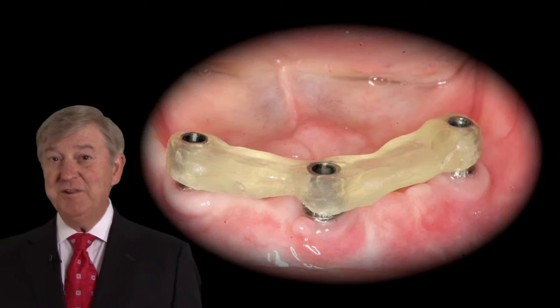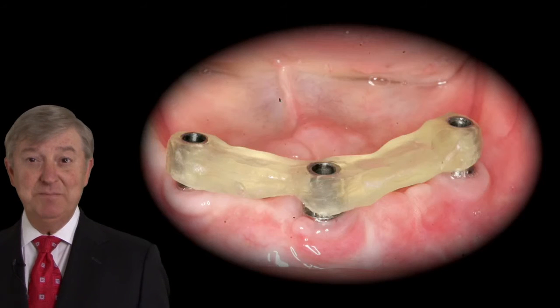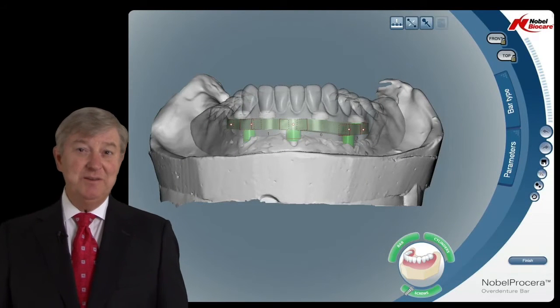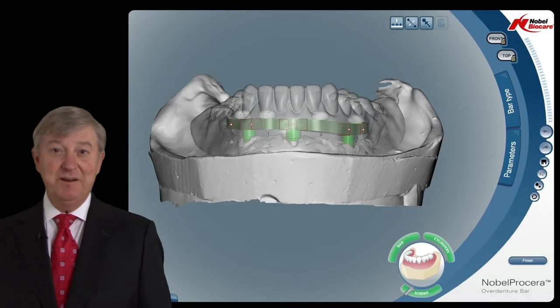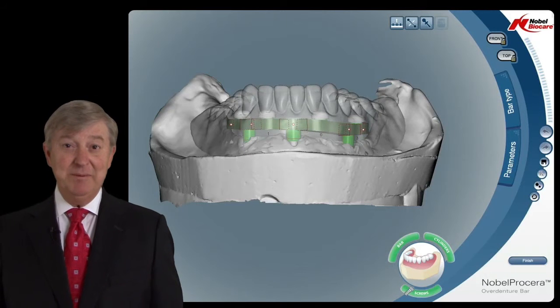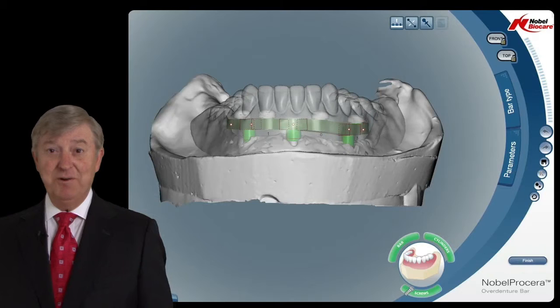In addition to a number of items, we'll illustrate the use of the acrylic verification stent and why it's important in CAD-CAM technology. We'll illustrate the exciting new technology available from the Procera form of software and milling capability to produce titanium bars and zirconia frameworks.